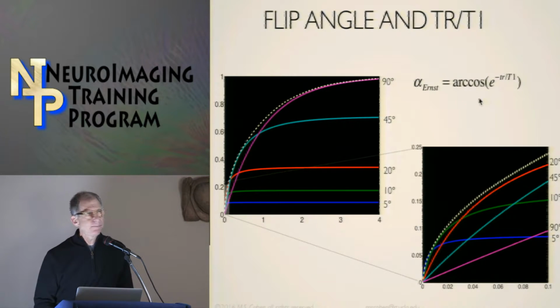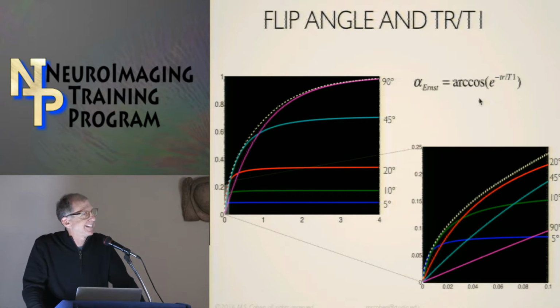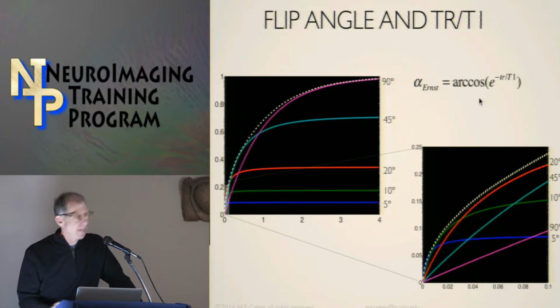Okay. It's a relatively important effect because in BOLD scanning these days, there's a lot of interest in scanning more rapidly. For example, resting state networks, everybody's seen people scanning with 400 and 500 millisecond TRs, which is 1/3 of the T1 of the brain. And therefore, the signal is being punished if you use a 90-degree pulse.